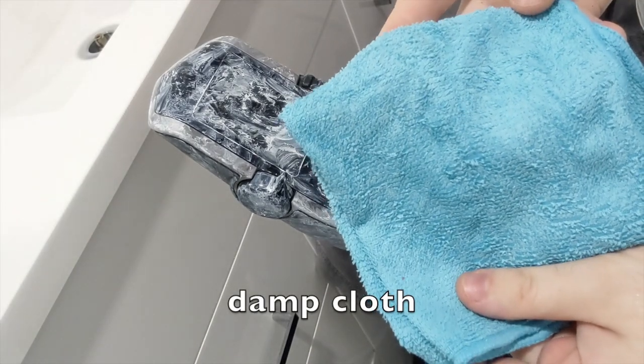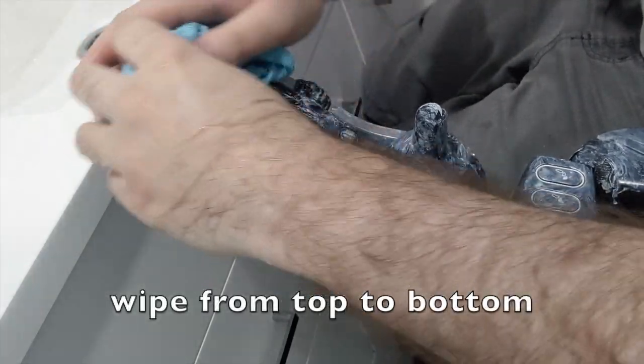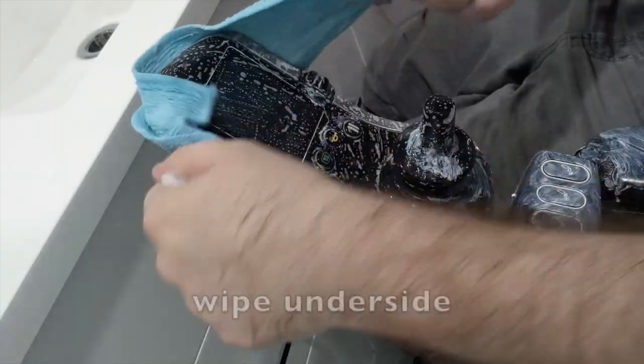Take a damp cloth and apply soap to the cloth. Wipe the controller from top to bottom, then wipe the underside.